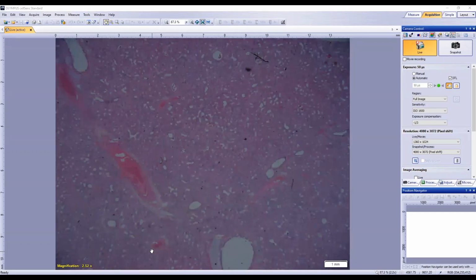Now, what's the distribution going to be for Rhodococcus? Multifocal, or multifocal to coalescing. Exactly. The video playback on these sometimes is going to look a little bit weird because we're going to be staring at a thing like this and just imagining something else.